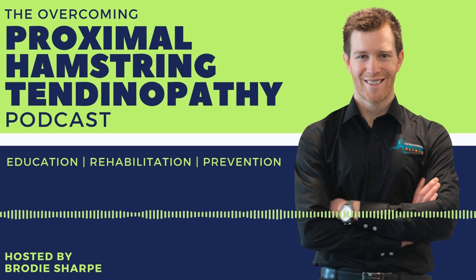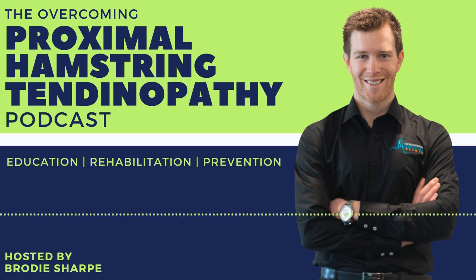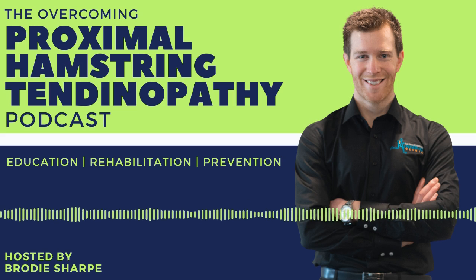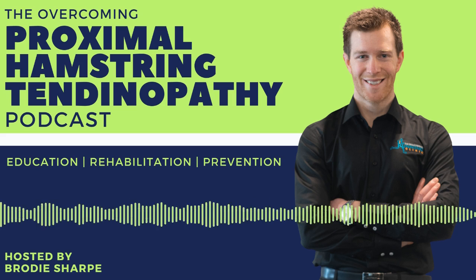So this might be quite useful for the listeners: when you have a shockwave treatment, it's very common to be a bit sore for anywhere from 3 to 5 days, but within a week it should be back to normal. That's why we generally have a gap of about a week. So the gap between sessions can be anywhere from 7 to 10 days. It doesn't have to be, though, and I'll give an example.